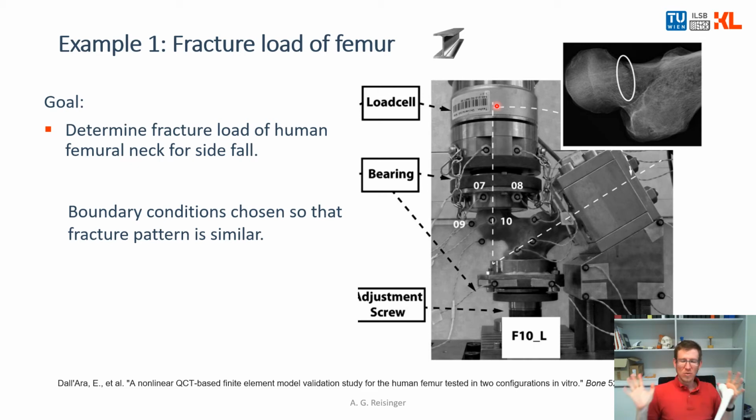And you see there are no soft tissues around, or any tendons or ligaments in place. This was the strategy here. Okay, what else do we see in this picture? We see a load cell. So here the force was measured.